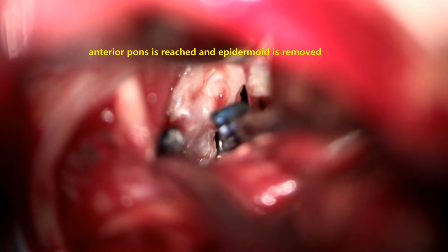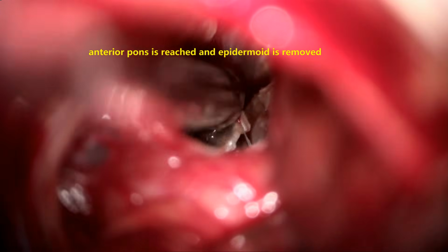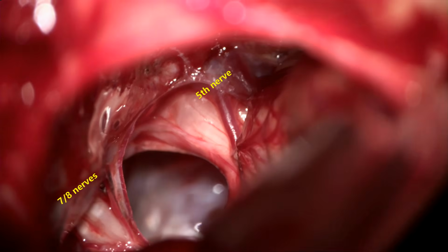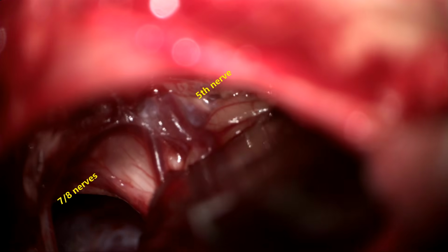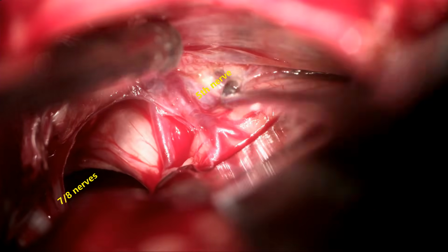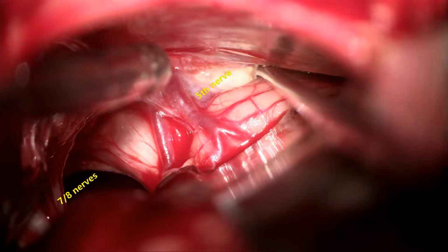Here, the tumor extends into the crevices and the deeper spaces where the microscope or exoscope may not show us the complete extension of these lesions. So in these cases, we always prefer to use the endoscope at every stage to excise these lesions.